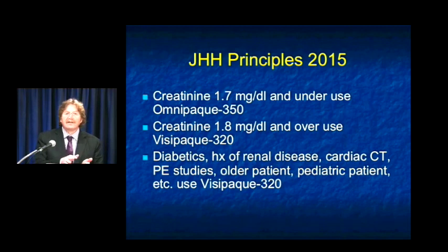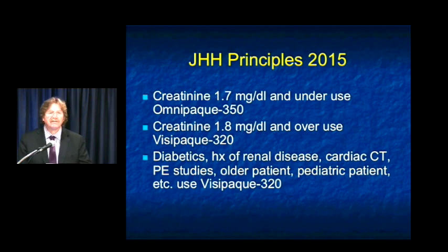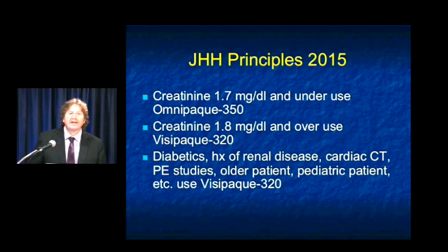There's no doubt that if cost wasn't an issue, I think everyone would use 100% Visipaque 320. It gives great comfort to the patient. There's very little side reactions. Omnipaque works very well also, but Visipaque has that extra level of protection, and that's been written about in many different articles. So that becomes our protocol and how we do things.